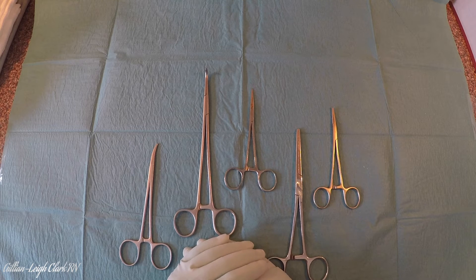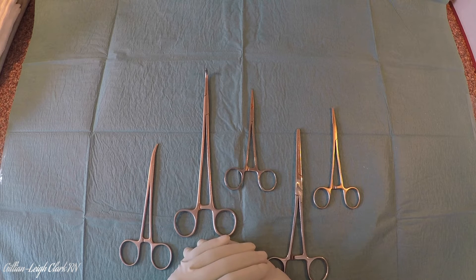Now you may not know what they're called, for they're all named after people, which makes it just a little bit more confusing, but at least you can tell what it's for. An artery forcep comes in many sizes and guises, but they will all have the same qualities, and I think that's a good way to start.